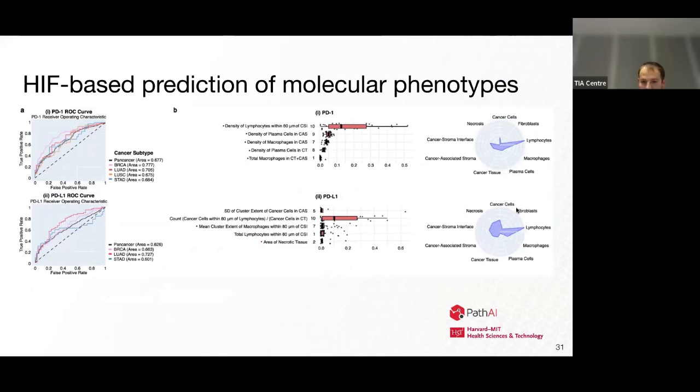Okay, and we are saying that lymphocyte is pretty dominant here, right? So what kind of features related to lymphocytes did you find most useful? Was it the density of them or the distribution? We think it's the distribution.